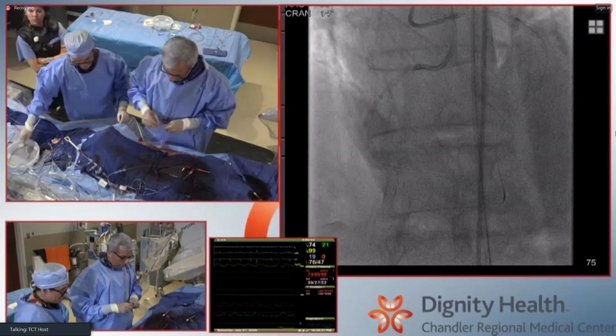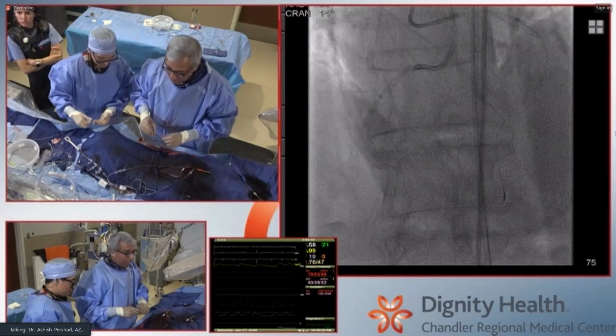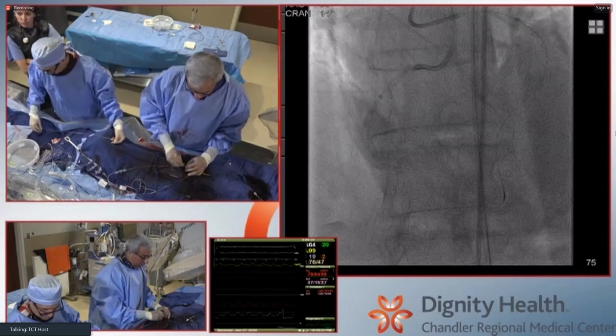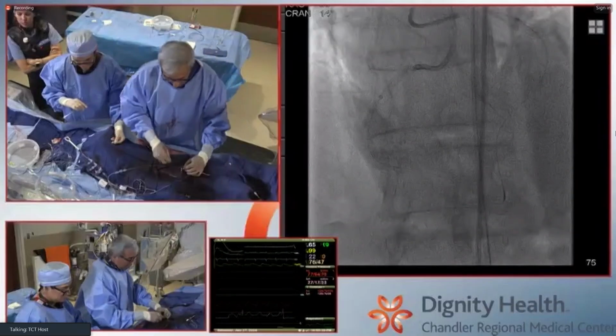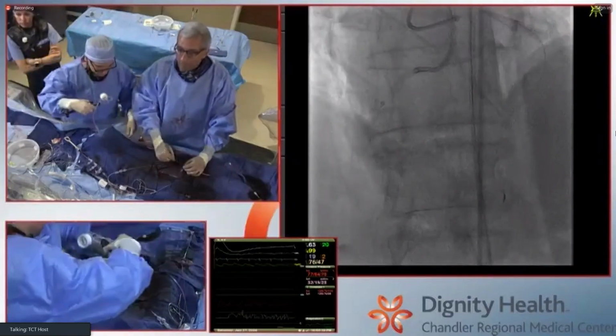The other comment was, I do think with the cutting balloon you have to be very, very careful. I agree. I've had some bad perforations with that. We are sitting in the adventitia here, definitely. Number two, in terms of the stent choice, we submitted some paper.